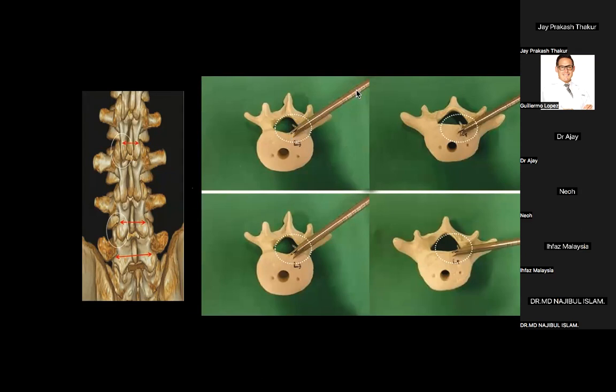Look at the angulation here. And look at the angulation here. They are almost both the same. With this angulation, we are into the canal. Can you see that? Your sleeve is inside the canal. Whereas at the L5 level, with the same angulation, you are inside the disc.